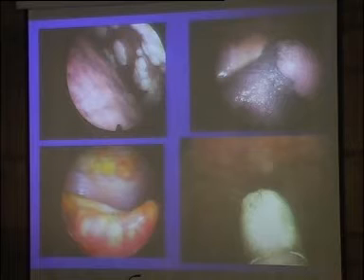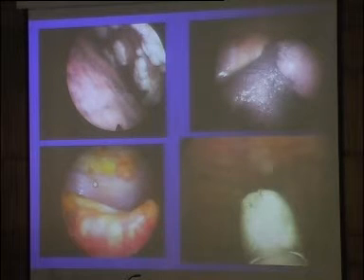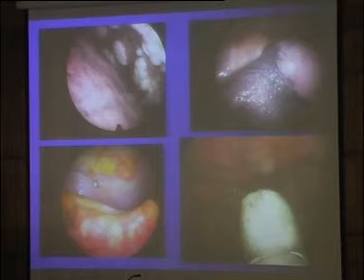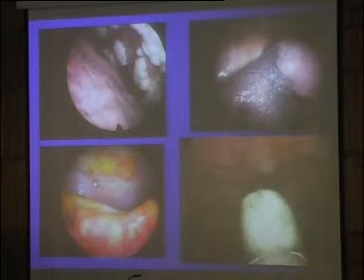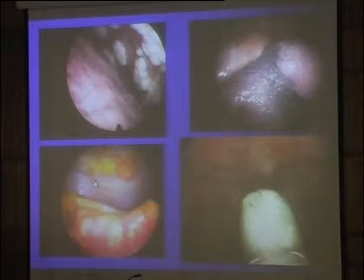There are huge nodules, but this patient got 8 percutaneous pleural biopsies within 4 months. What does it mean? It's impossible. Fluid, strong suspicion of cancer, means thoracoscopy. In this patient, we removed the chest tube on the table. He was discharged the same day. In 1 day, you rule out 4 months with 9 percutaneous biopsies, pain for this patient, anxiety, etc.